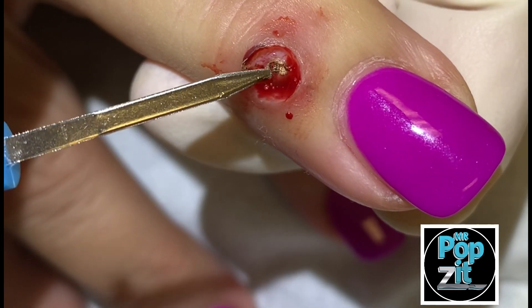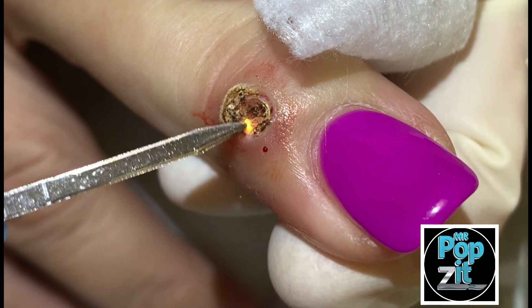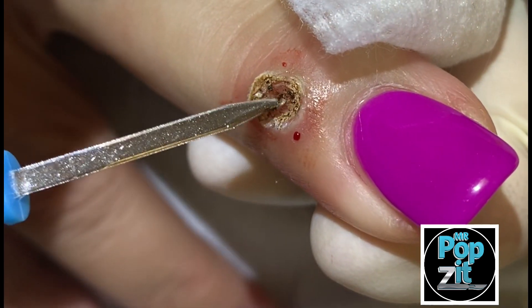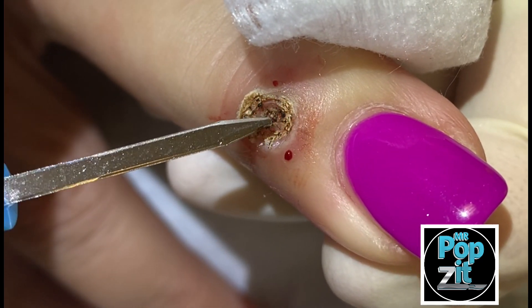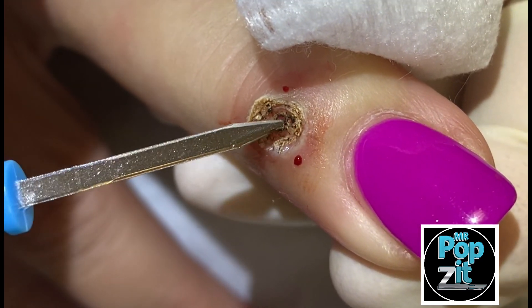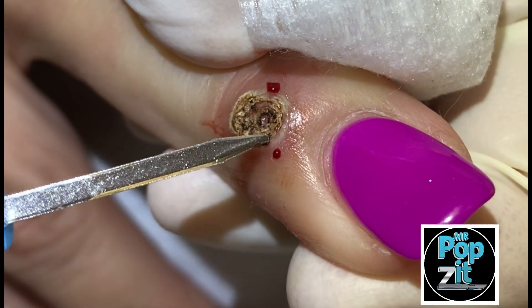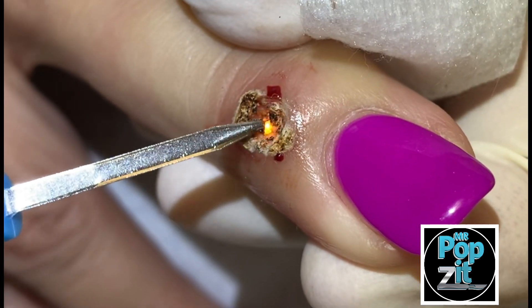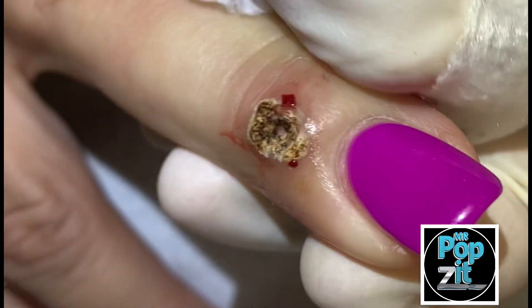Right there in the middle. We put a little pressure bandage on here too. This will turn into a scab here. But it's that center area right there where you could see that coming in — that's where I want to kind of burn that so it doesn't have a channel coming out from the joint again to fill back up. This one has filled up two or three times. So we're going to make a scab there and that should stop that from refilling.